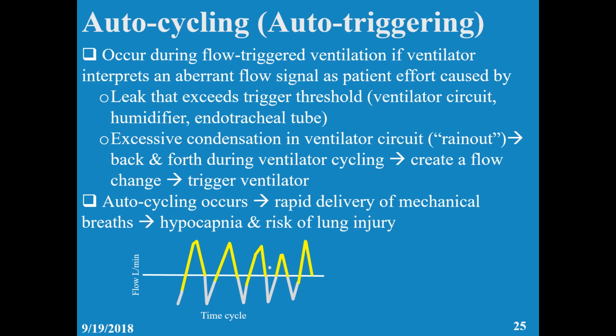However, sometimes the difference is due to leak. So when you leak, there is a difference. If the leak is more than the set trigger, then the machine will think that this is a trigger because that's a difference. So remember, if the artificial difference, not the patient difference, between the in and out is more than the threshold, more than the trigger, the machine will think that this is the trigger.